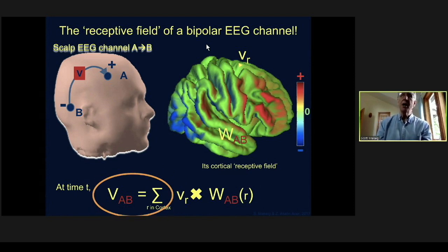Now take another time. All the activities have changed in all these colored parts of the AB filter, and so in the parts that are shown colored in the AB filter, that means the voltage at that time is going to be an effective sum and difference of all sorts of different activities.